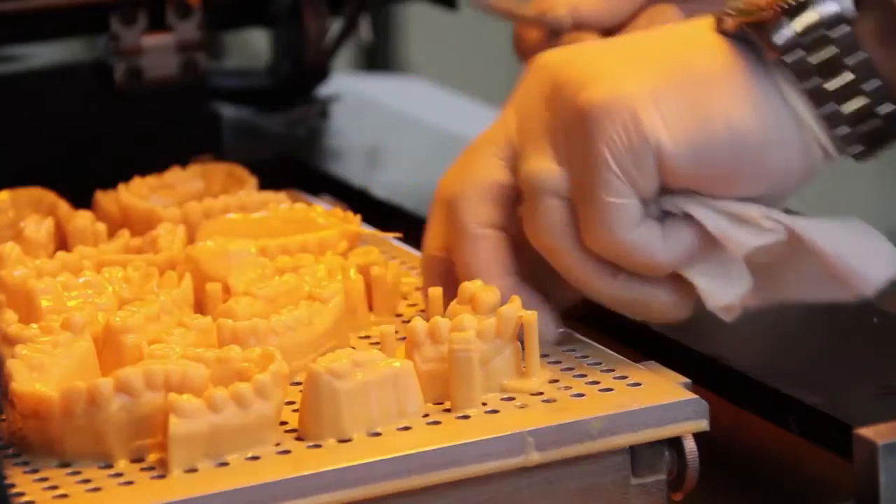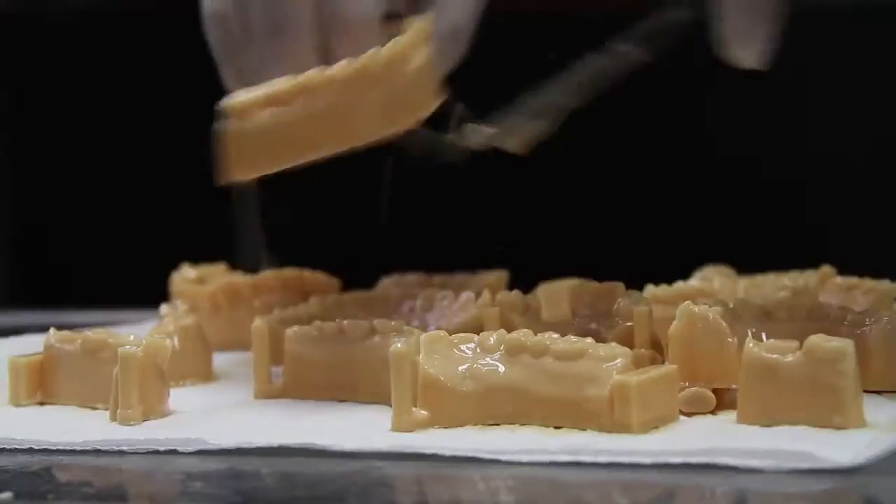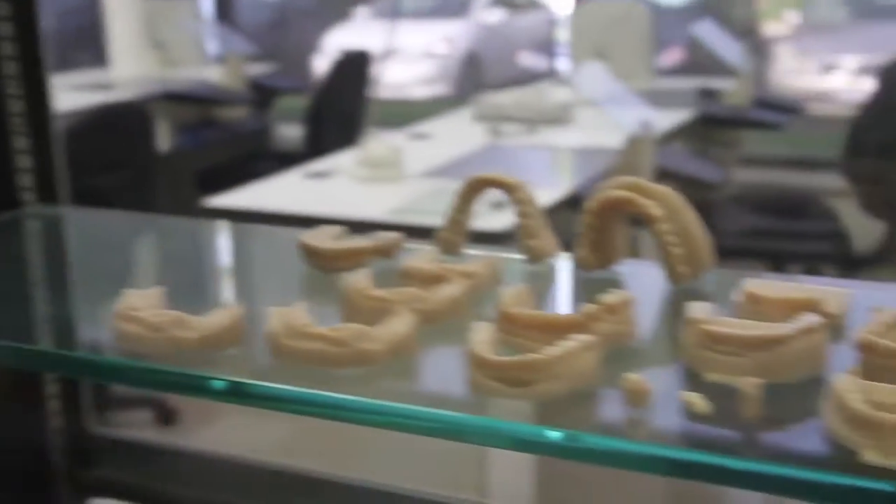These models have the lowest per part post processing time in the industry. That means in about 15 minutes I can post process an entire platform of models with virtually no hand holding of the models throughout the entire process.